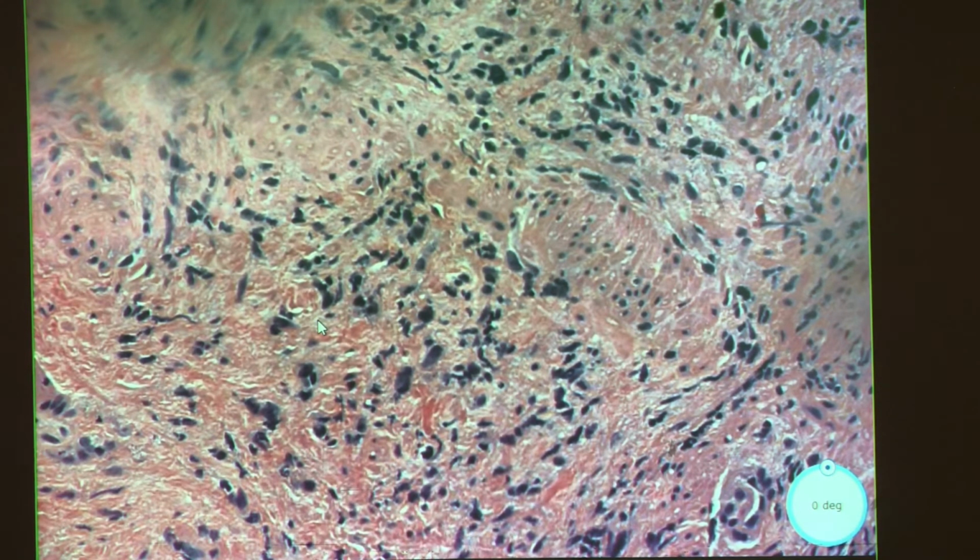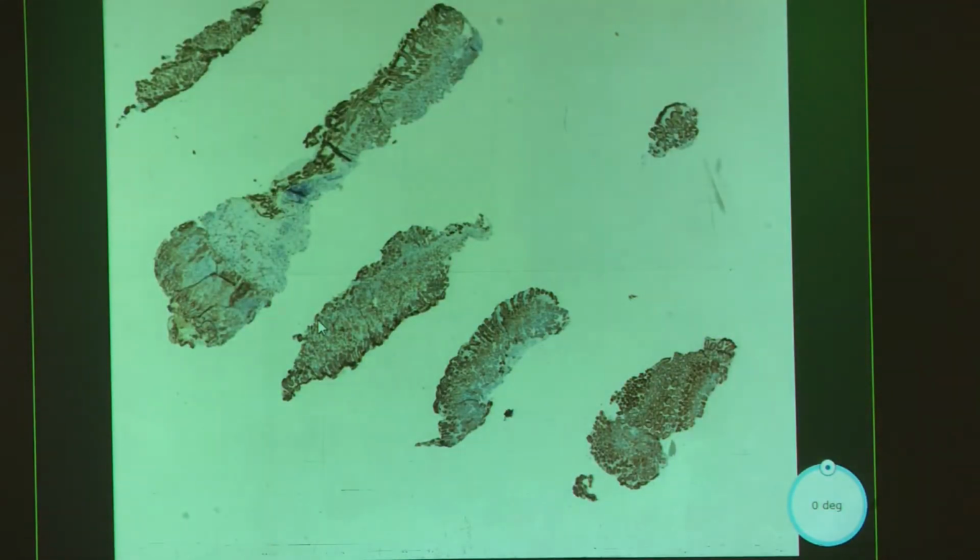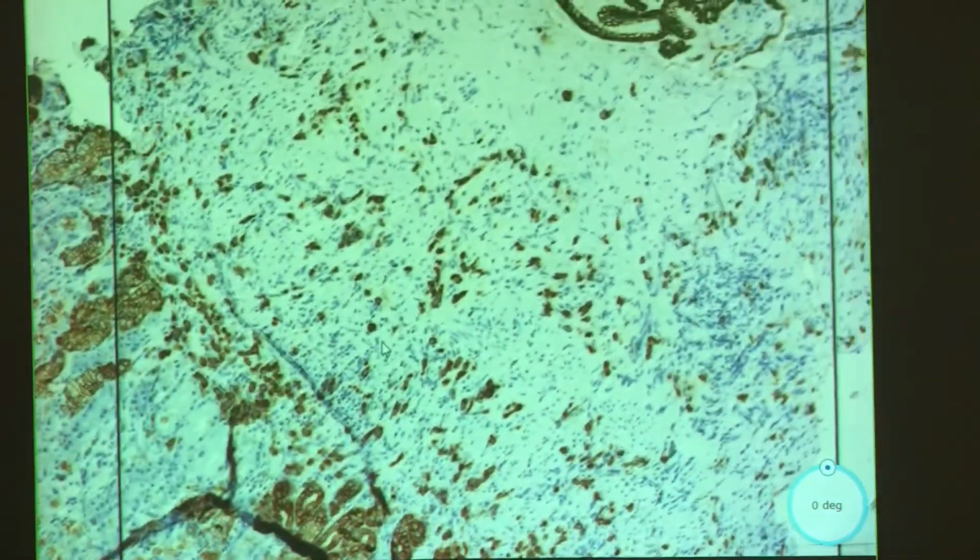Yeah. I'll give you one, to determine if it's carcinoma. You could do a keratin stain, like that. Perfect. That's exactly what I'm going to give you. And alright, boop. Okay. Annotation.